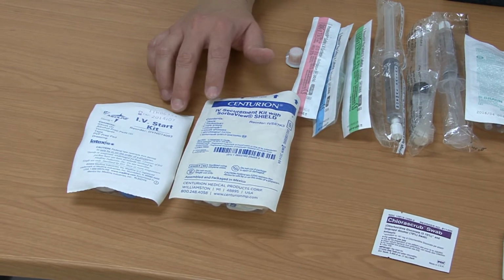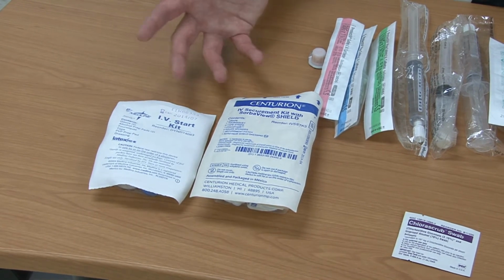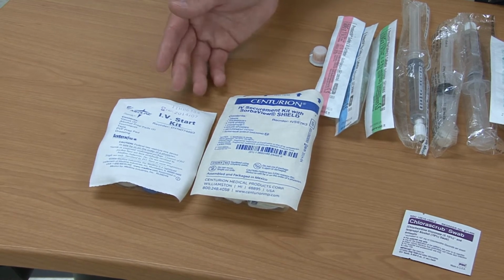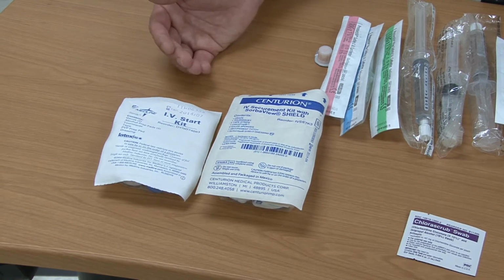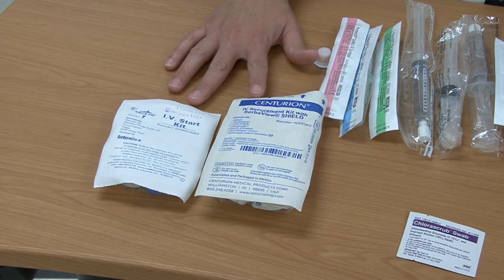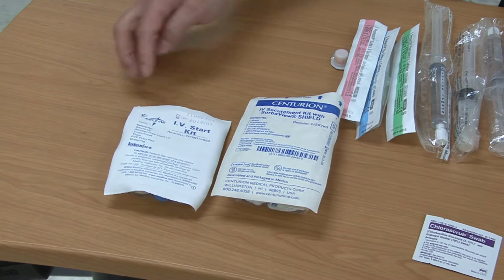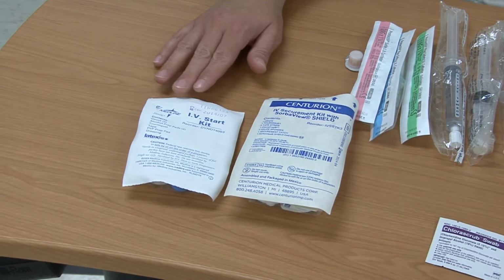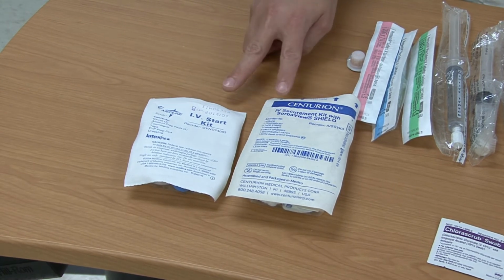You'll also have the tourniquet, which helps you apply pressure so that the veins will pop up or sit up for you so that you can see them better. They also have some gauze in there, which you can put underneath to catch any blood that does leak out. And then also a securement device. But always make sure with any of your packages, as we've talked about in previous videos, that you assess to see that they are clean and dry and intact and that they're within the expiration date. And check for what is exactly in them, especially latex, and make sure your patient doesn't have any allergies to any of the things that are in the kits.